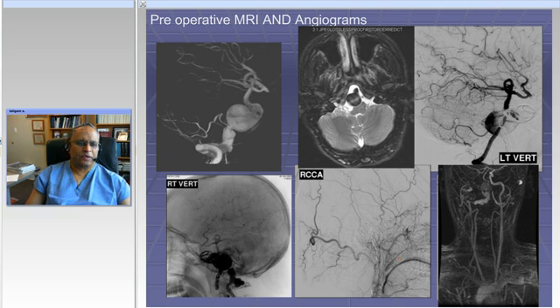So what has happened to this patient is, first of all, focus on this MRA. Left ICA is okay. Right ICA is occluded. And here's one vertebral. The other vertebral has developed a very large giant aneurysm. You can see that here. And the PICA is arising right in the middle of this aneurysm. This is PICA, and here is the aneurysm, and the vertebrobasilar junction is right about here, and these are the old coils.